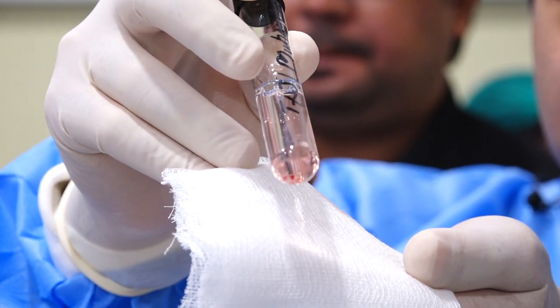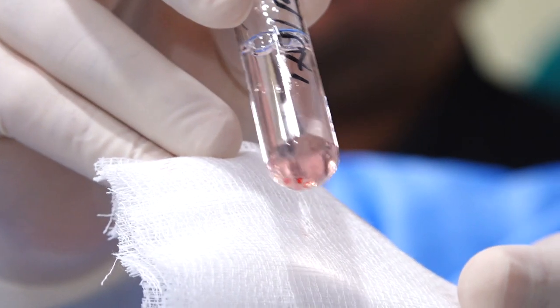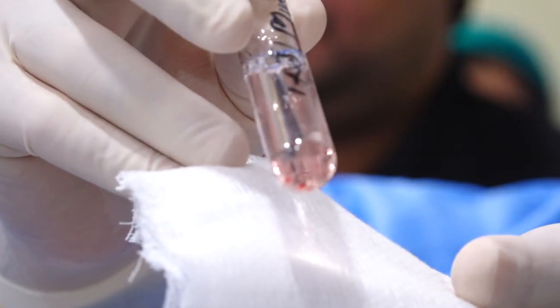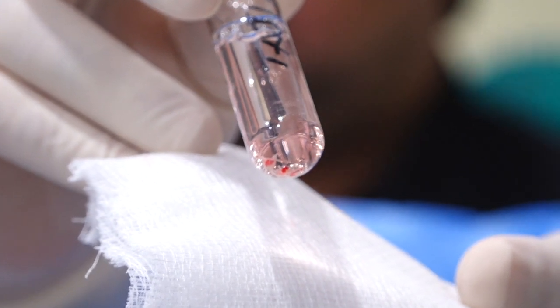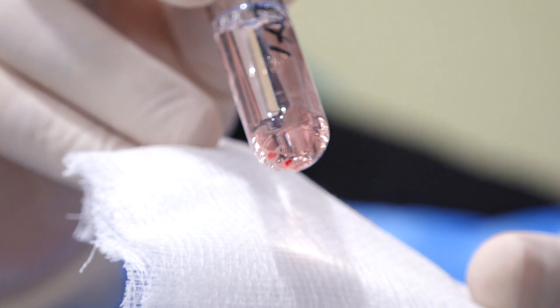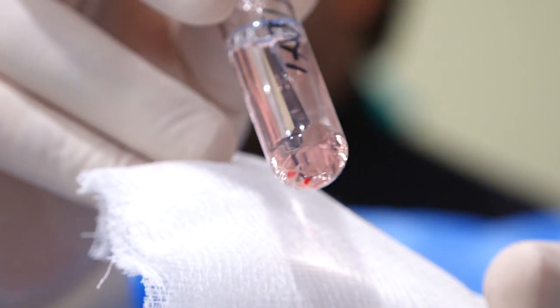Do you guys see like there are some cores sitting in here? Just hang in there, don't move too much, guys. If you can just hold still and let him focus. So here, you see, this is a bright red blood, right? And then there is some more like white tissue. It's not really more blood in there.